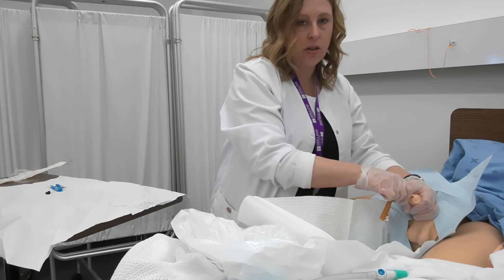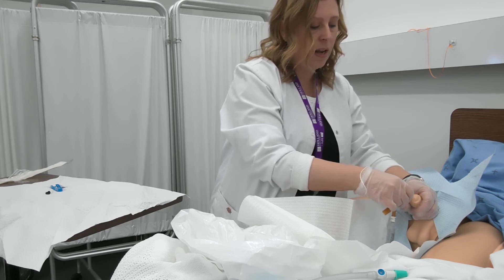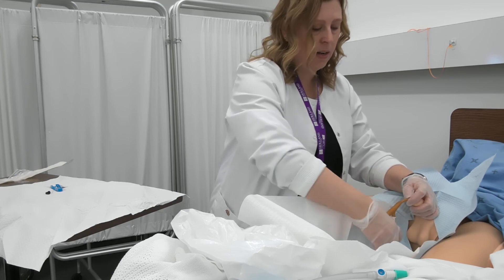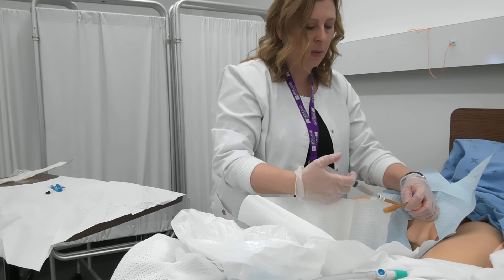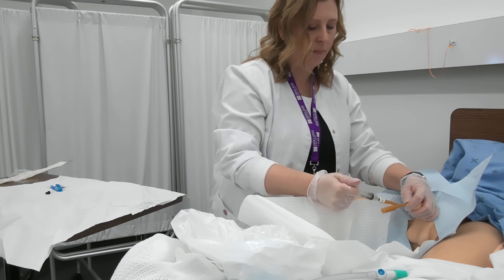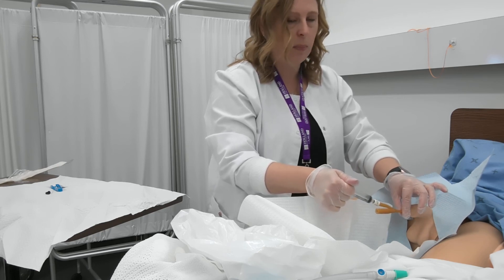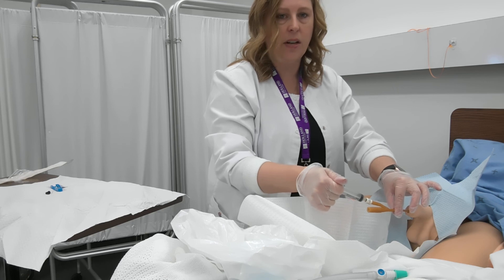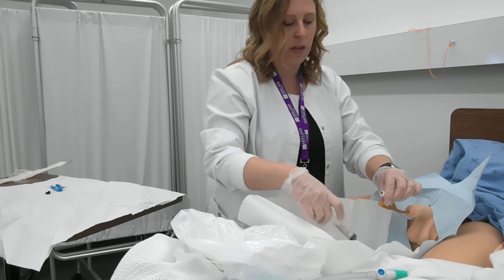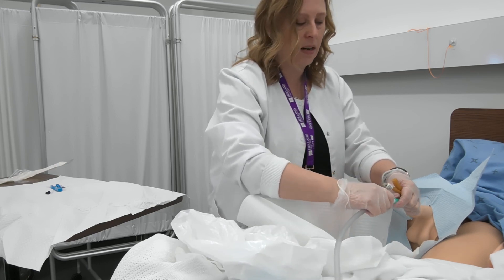Once urine starts to come out of the catheter, you want to insert another couple of centimeters. Then with your non-dominant hand, you're going to hold the catheter in place while you go ahead and inflate the balloon. Once the balloon is inflated, let go of the penis and pull back slightly on the catheter until you meet resistance. You can then disconnect your syringe from the catheter and connect the sterile bag.